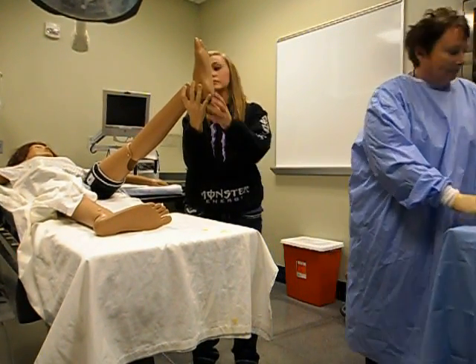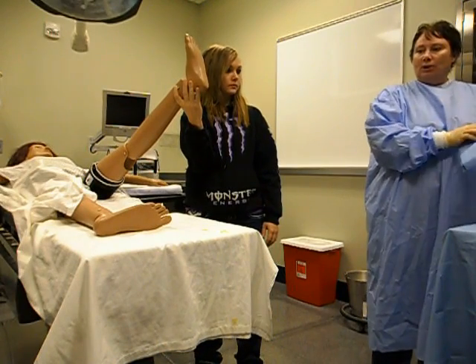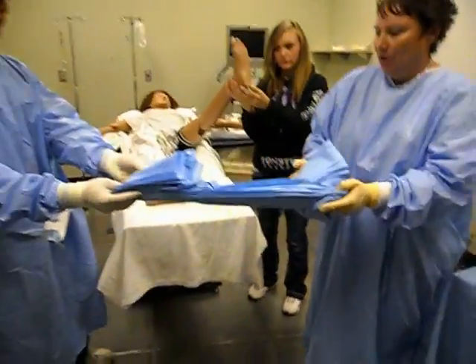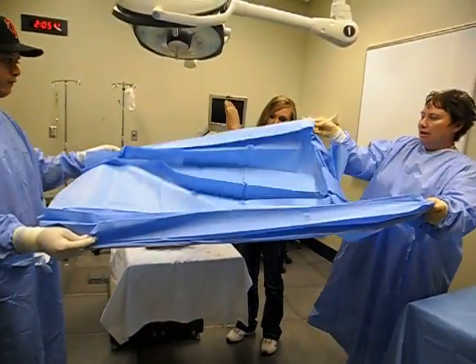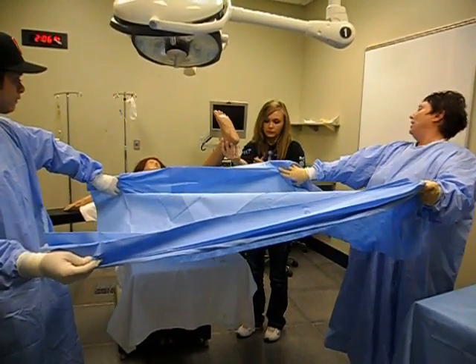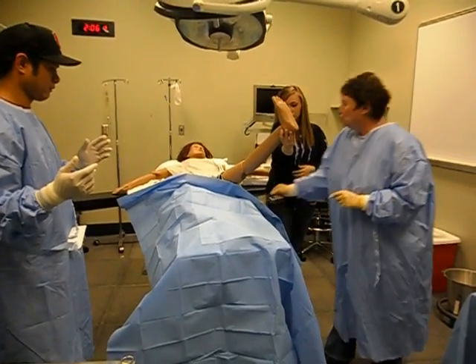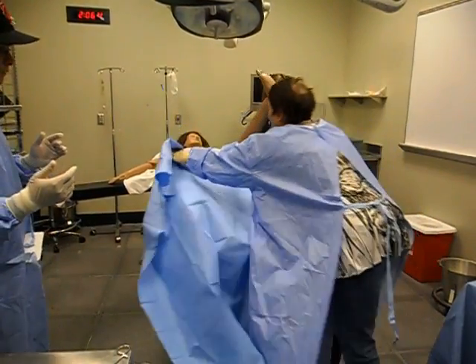The first thing we're going to put on is a sheet, and there are a couple of ways we can do this. If I have my assistant here — Wettner — Wettner can come to that side of the table without touching the table. Grab this drape at the foot of the bed, open it up, protect your hand, and we can slide it in. Use your right hand and kind of pull your body back so we can get this in exactly. One way of putting the sheet on. You could have opened up this sheet, protected your hands, and done it yourself without somebody helping you.